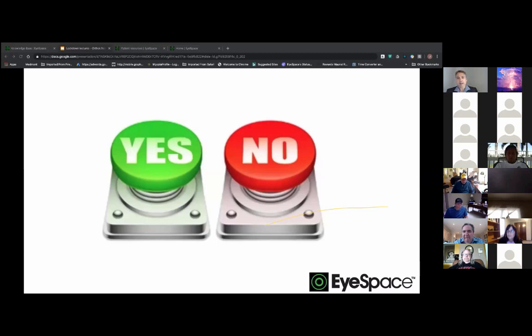Sure. So prescription is a basic guideline, but obviously you've got to evaluate the cornea, and there's a number of aspects that one can look at, which is a whole topic on its own. And then maybe just quickly touching upon motivation and personalities. For me, the key point is the patient needs to want to do it as well. You need buy-in from the patient, and you've got to look at personality types as well, vocation. What's the motivation for them wanting to do Ortho-K?